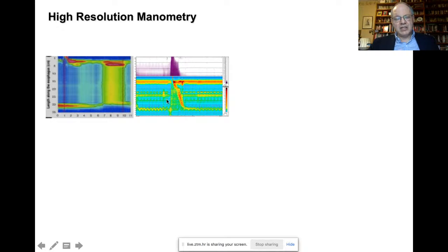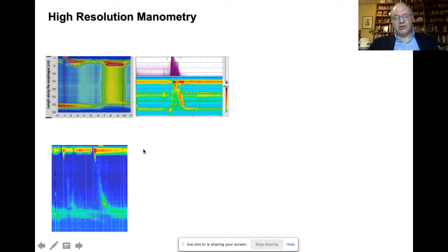And this is something easy to diagnose when you perform a manometry with a test meal and a postprandial evaluation. This is a typical pattern of rumination, straining with liquid coming up into the esophagus. Another use of manometry in reflux disease is the detection of esophageal body hypomotility. This is a patient with ineffective esophageal motility, which can be involved in reflux disease.